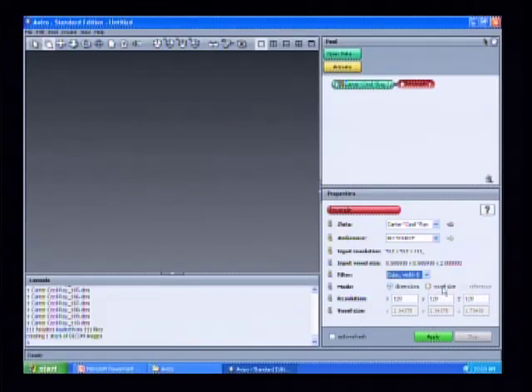And then we want to click on the voxel size, which is in the mode option. So click on voxel size, and we want to get rid of all of the numbers that are currently here, and we are going to change them all to 0.8. We're trying to make it a high-resolution scan, so you'll see that the voxel sizes were very large, and we're reducing them, and then we're going to do an interpolation to kind of smooth out our data.